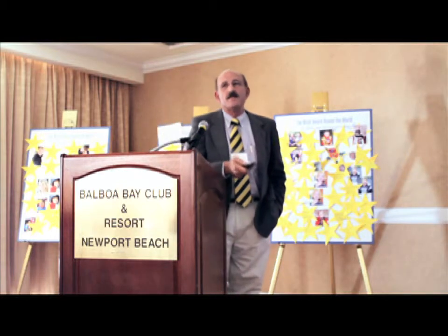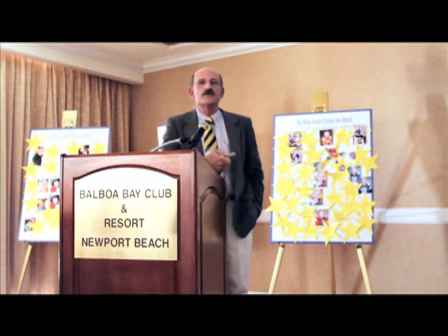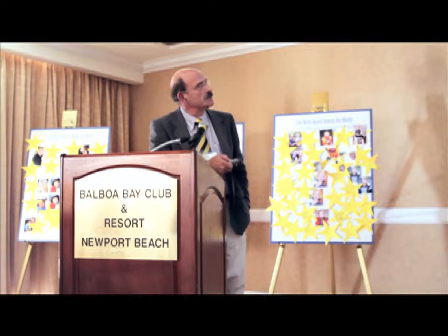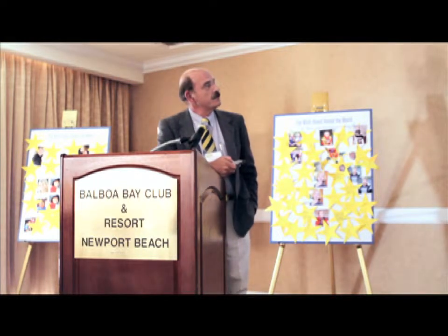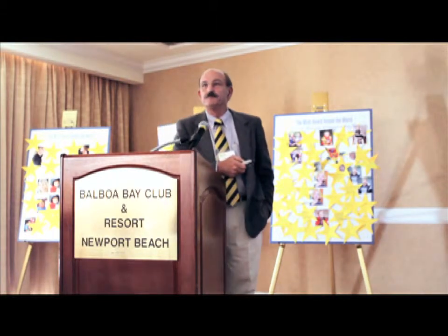Since we're looking at the same animal over time, we can make these same measurements and see how crystals deposit over time and then look at the effects of therapy. And that's what we've sort of done here, looking at the temporal sequence of crystal load in a series of mice. You see, we first detect crystals at 3 months. They increase in number and size up to about 7 months, and then they appear to drop off over time.